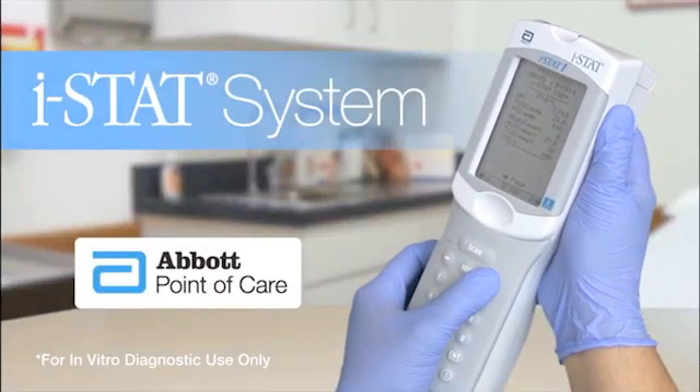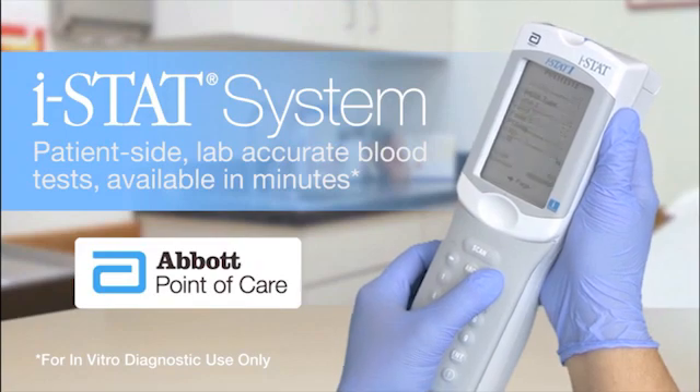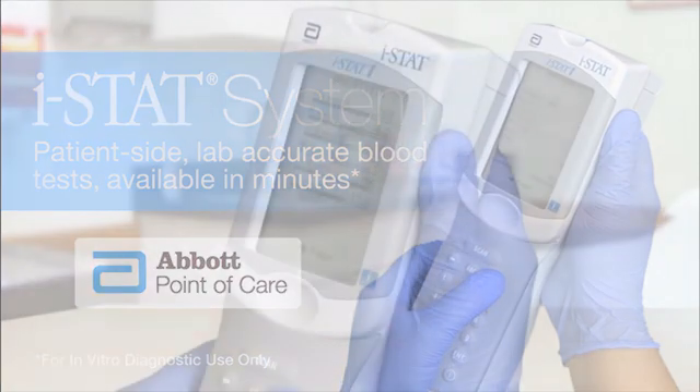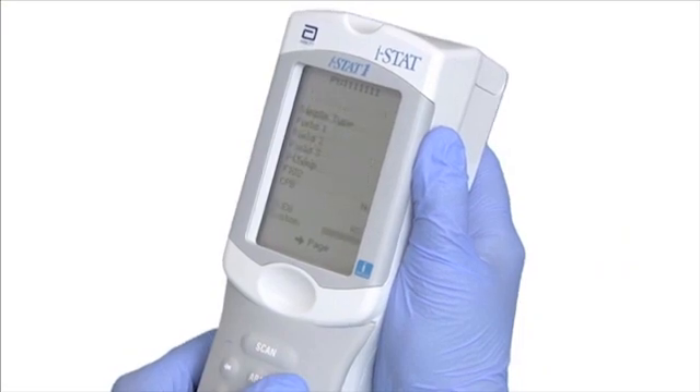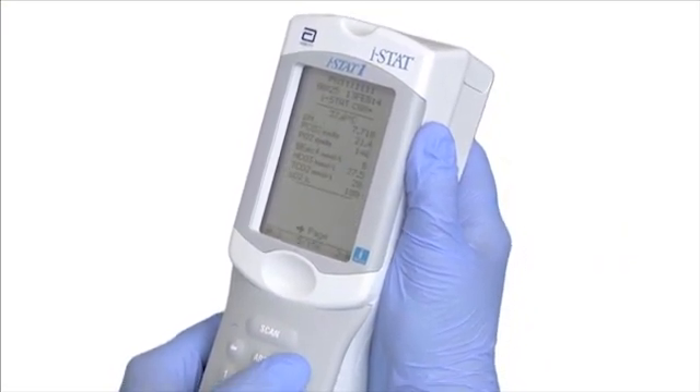With the iStat Blood Chemistry Analyzer, patient-side, lab-accurate blood tests are available in minutes. The iStat Analyzer was designed with ease of use in mind. Performing a patient test requires just a few simple steps.